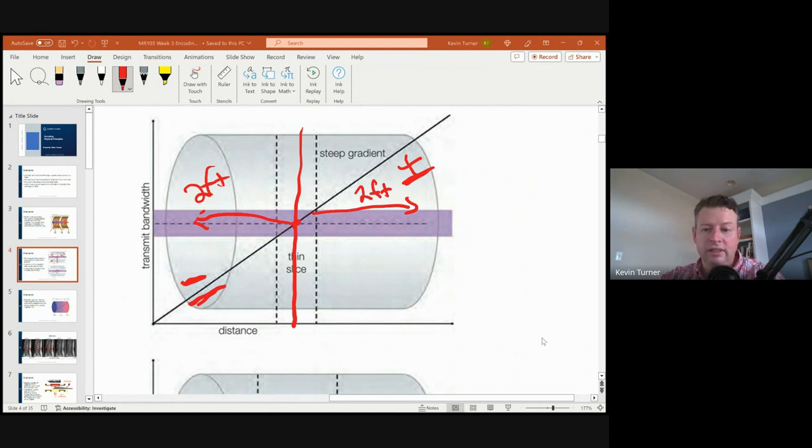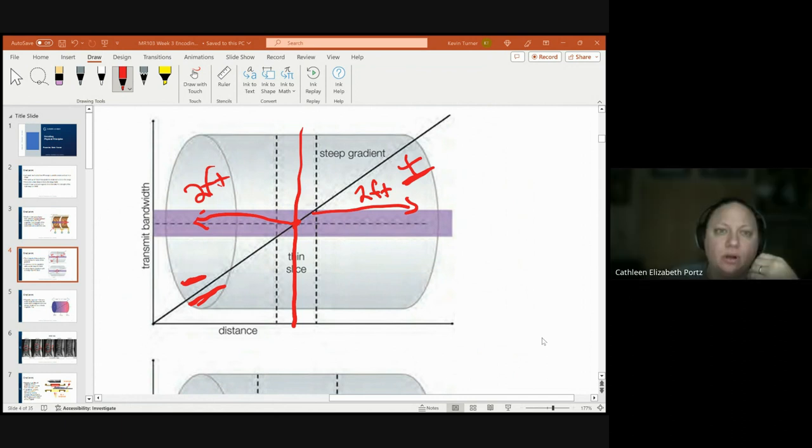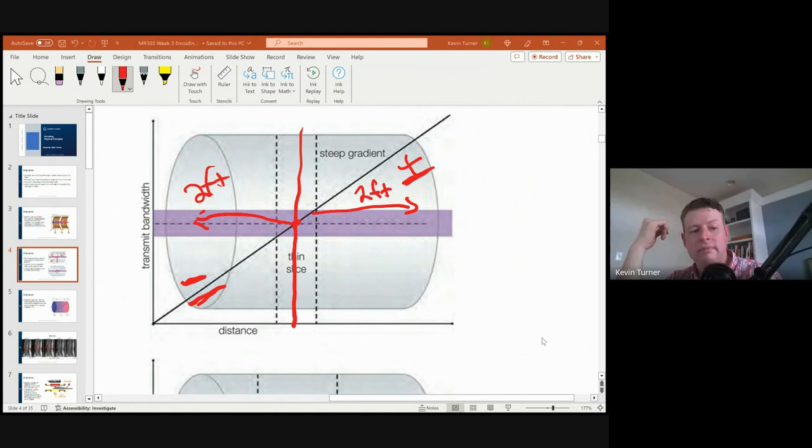Yes, that's the isocenter. That's also the best place to scan the patient. Go ahead, Kathleen. So the gradients never change or alter the strength at isocenter. It just shifts it on the ends of the B0 field. Correct. Now, when I say isocenter never changes, isocenter is a very tiny, microscopic area. It's the dead center of this gradient force. It's not like the isocenter is a foot long. It's a very, very tiny area. But the very center of the magnet never has its force change.